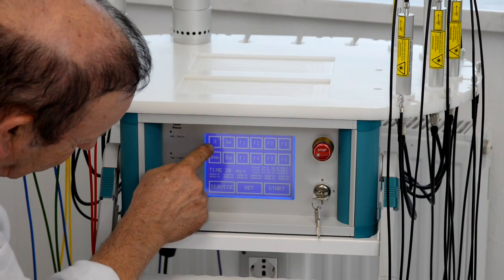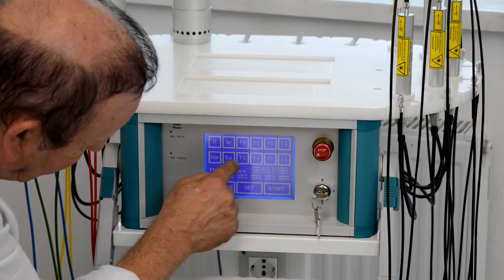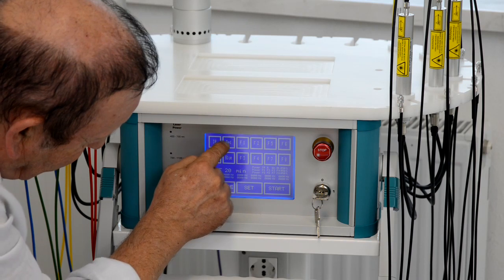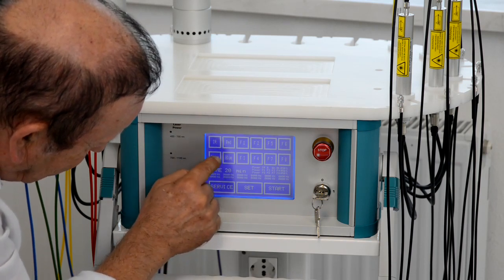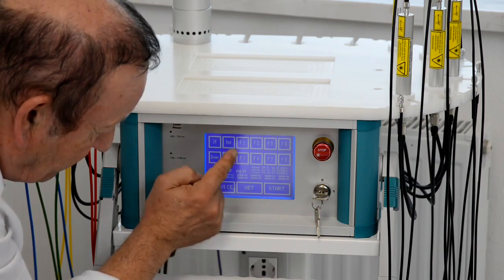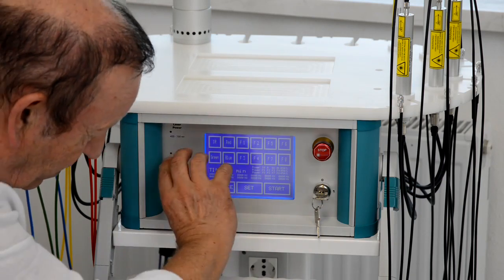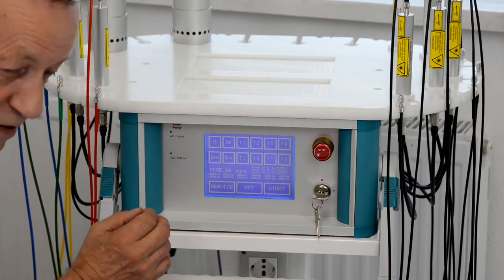So you find infrared, green, blue, red, and the 8 free channels. And you remember we have set the 5 milliwatt red on red, the 5 milliwatt blue on blue, the 5 milliwatt green on green, and on F1 we have put the 5 milliwatt yellow, and F2 the 5 milliwatt ultraviolet light. After switching on, the device is in a so-called preset.